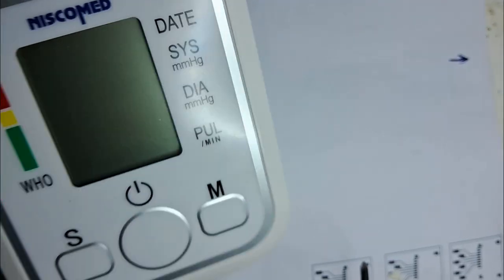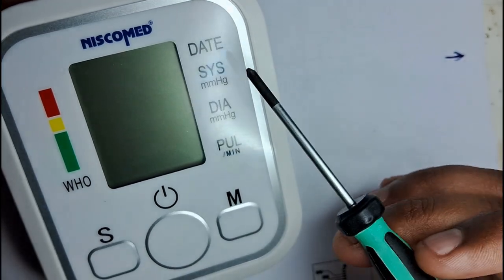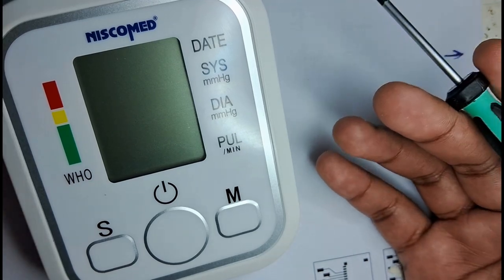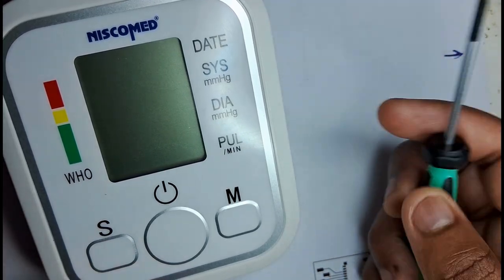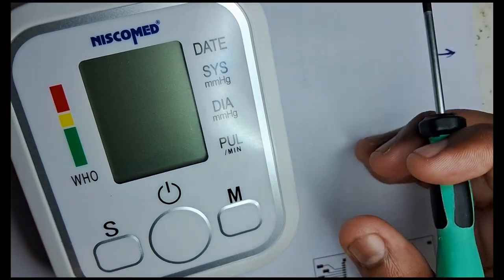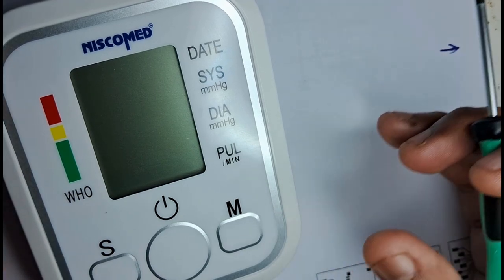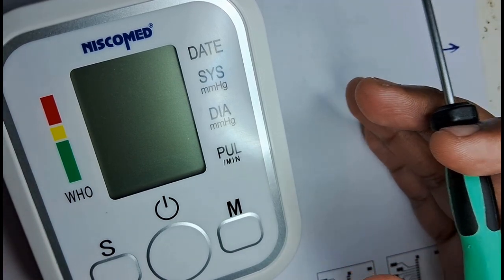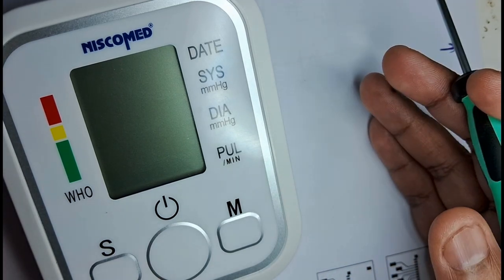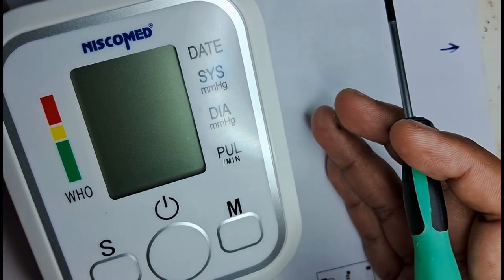So, this is a blood pressure monitoring system. Okay, so this is a digital blood pressure monitoring system and it's quite a portable one even. So today in this session, we're going to tear it down and understand how these medical devices work, and we will understand what the specifications of the major components used to make this blood pressure monitoring system are.